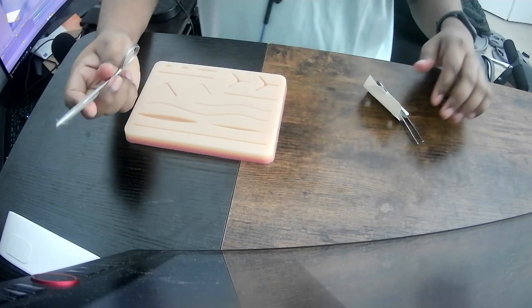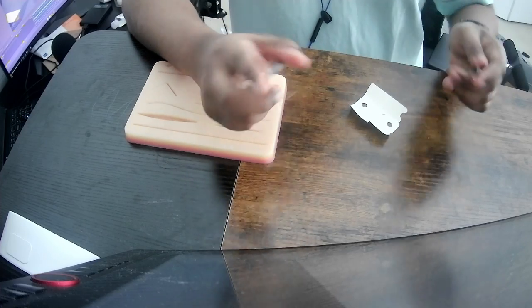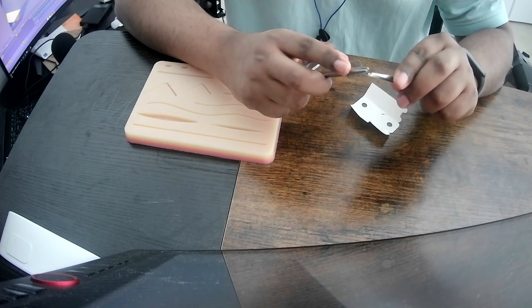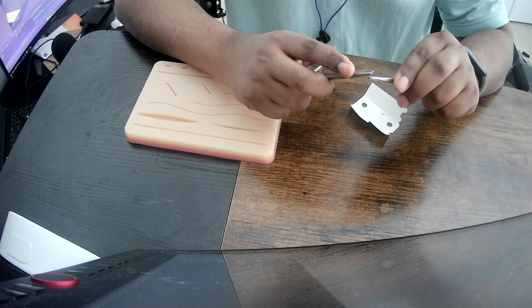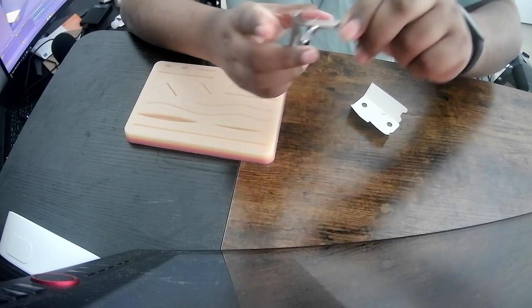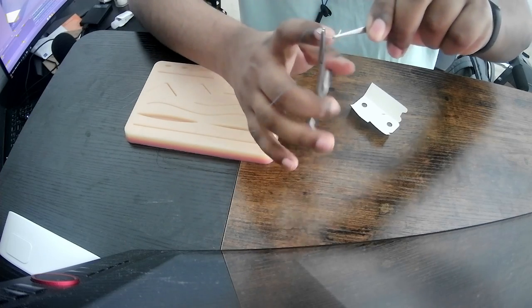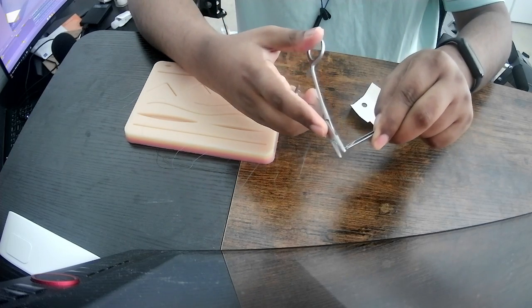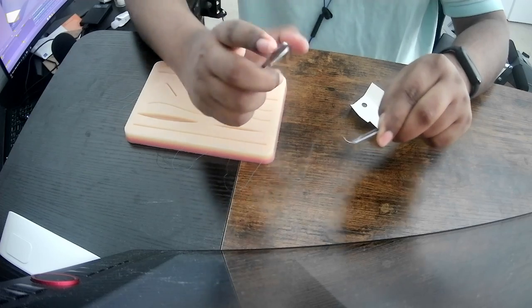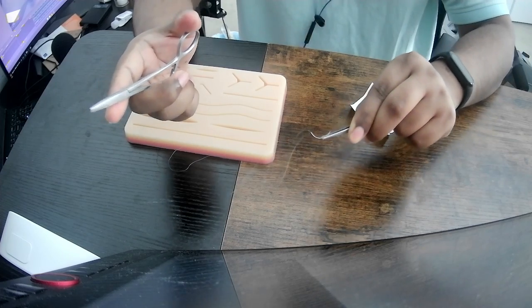Okay. I don't know, it's kind of coming in my way. Okay, so we have the needle. Let me practice transferring it back and forth. I need to master the basics essentially before I try suturing. Okay, I have a good grip. See, I can even do this. Okay, let's try to unlock. Oh, that's a big shock there. Okay, still secure.